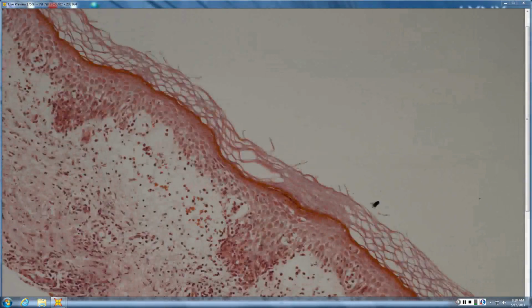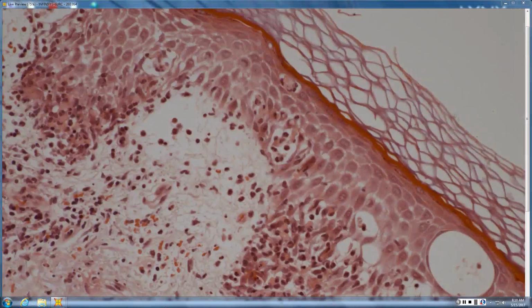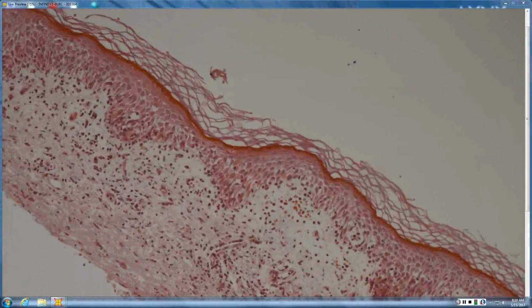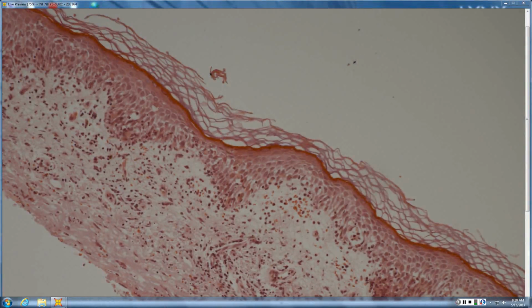Looks like quite a bit of spongiosis and papillary dermal edema with some extravasated reds. So there are some extravasated reds. There definitely is some sponge. Is it exclusively sponge? Is there interface? A little interface there too. And dead reds, right, which go with interface, not with spongiotic. So you got a mix of patterns.